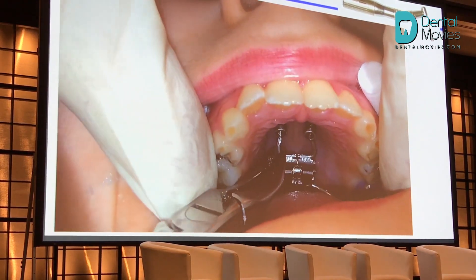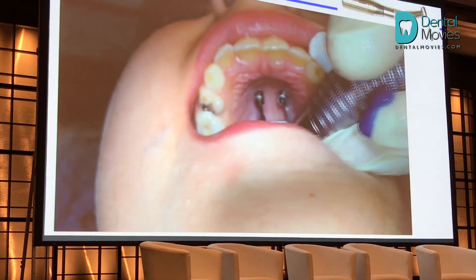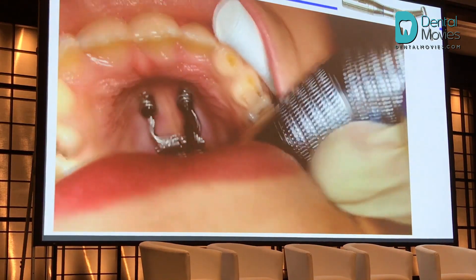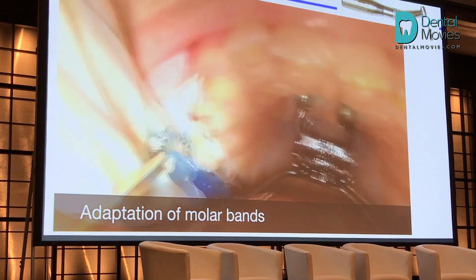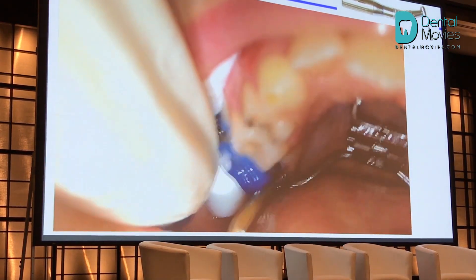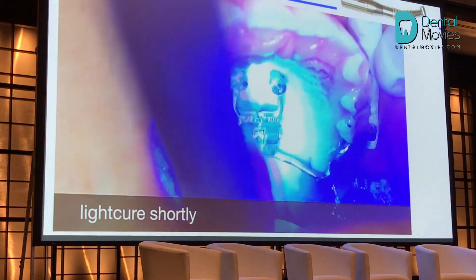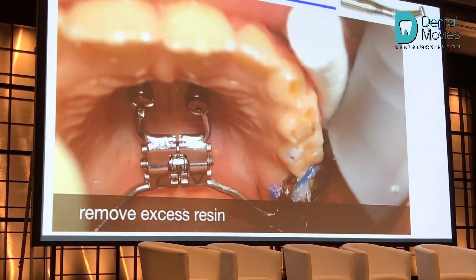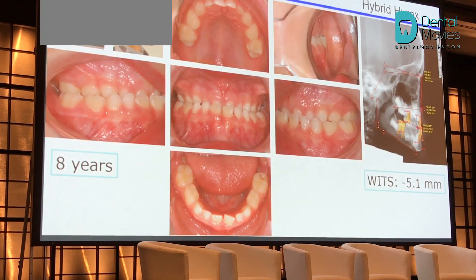The abutments are put on top of the implant heads. The screws fix the appliance to the mini implants. We use this bandlock cement, light-cured. Then we have enough time to remove the excess. And that's it — actually a very straightforward procedure.